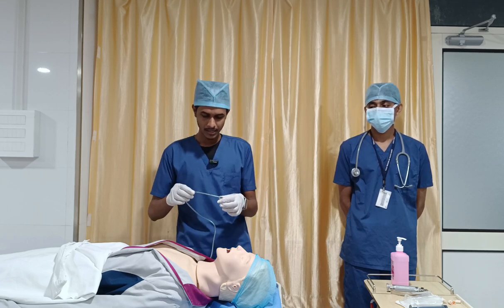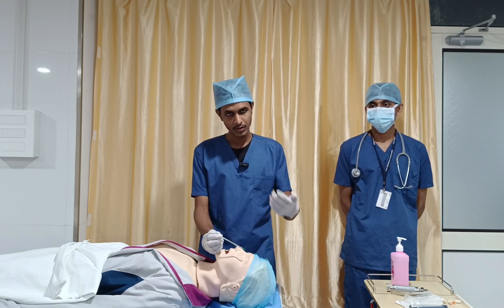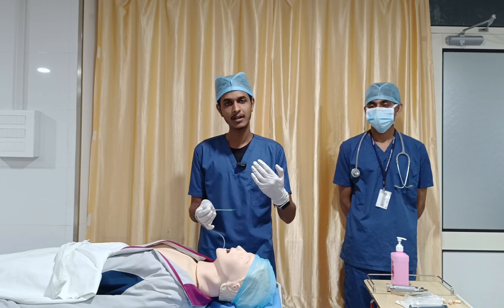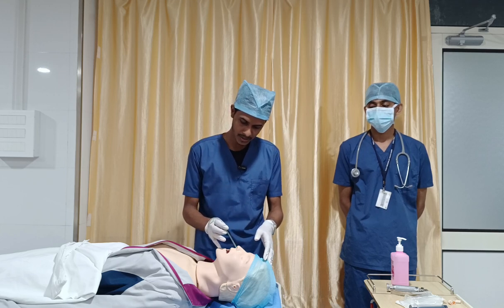And then before getting into the insertion, if the person is conscious, just warn them that you are going to insert, and then you can select the left or right nostril. Before that, you have to do the local examination first. So slowly get into that nostril.